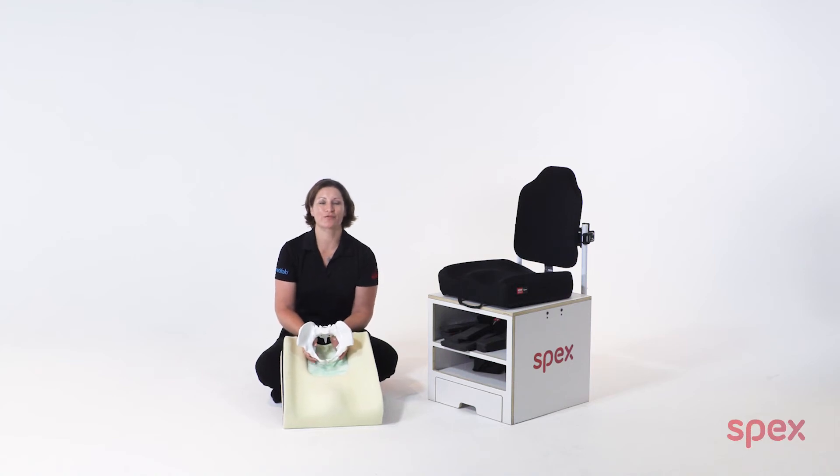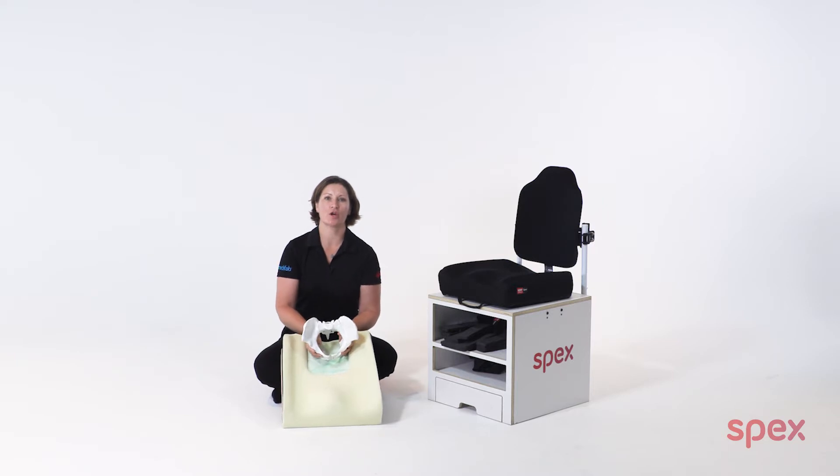Hello. In this video I will focus on the adjustments of the strategic positioning base for hip rotation when a wheelchair user presents with correctable hip rotation and can achieve a more neutral pelvis alignment in sitting.